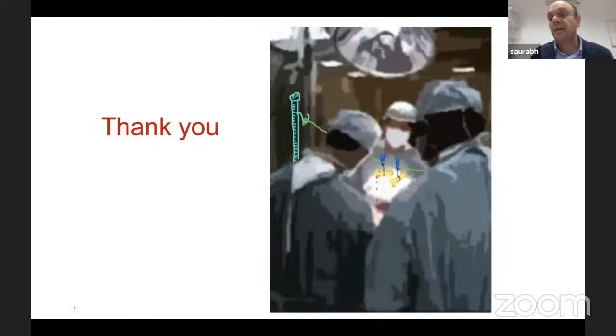So basically, arthroscopy is about knowledge of your nerves and your bony landmarks. You need to know where to put your portals and which portals to use for which shoulder work, to understand what to see inside. Visualization equals hypotensive anesthesia and managing fluid pressures, and then triangulation. So once you can do that, as I just showed you, the cuff repair and the SAD then fall in place. It's not that difficult.